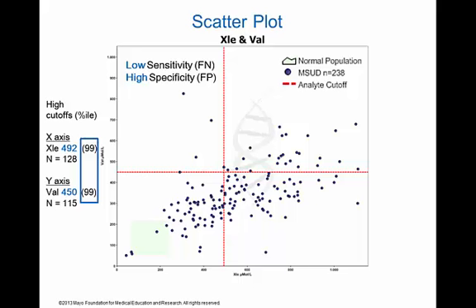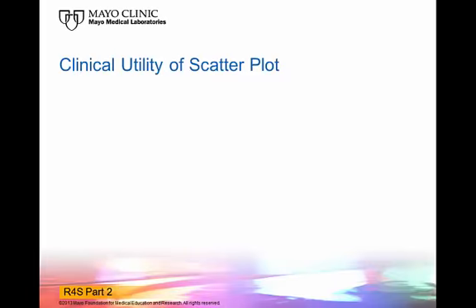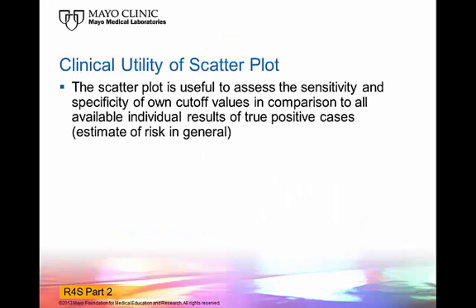At the opposite end of the cutoff ranges, with the cutoff values corresponding to the 99th percentiles, which are 492 for isoleucine-leucine and 450 for valine, a majority of affected cases would be missed. This is far from being a hypothetical situation, because these are the actual values used by one laboratory in its routine screening practice. In summary, the scatter plot could be viewed as a testing environment where a laboratory could verify its choices of cutoff values against the cumulative experience worldwide.